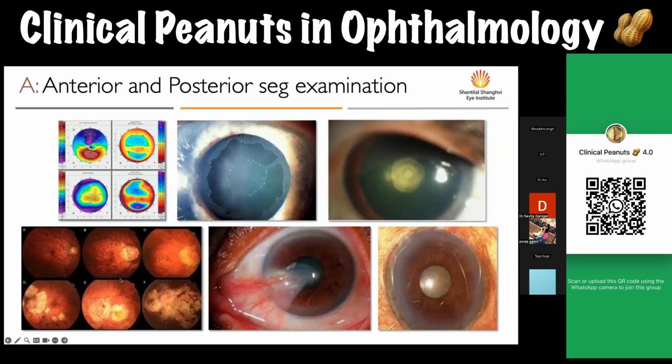High myopes, again, are a relative contraindication because they have large bags and weak zonules, and sometimes these toric lenses tend to rotate more in myopic patients. Any cause of progressive increase or change in cylinder, such as this advancing pterygium, might again be a contraindication to placement of a toric lens. And these hard cataracts with small pupils and weak zonules are again relative contraindications to placement of toric lenses.